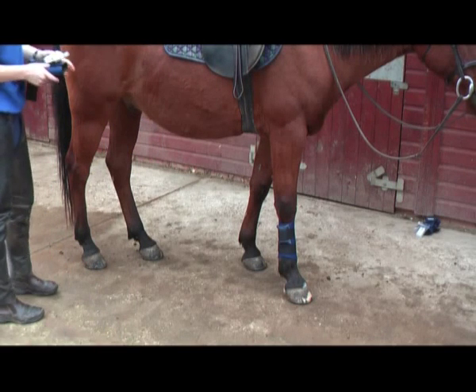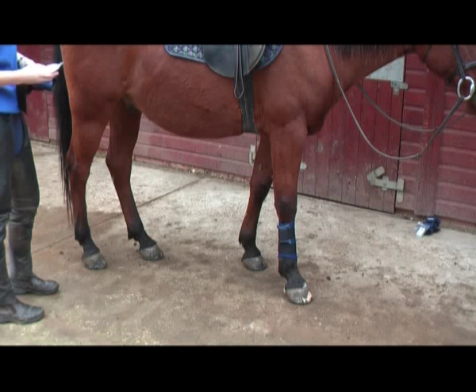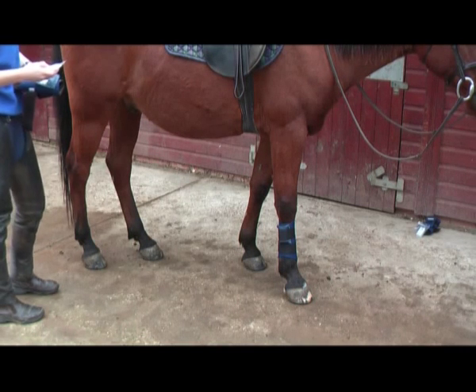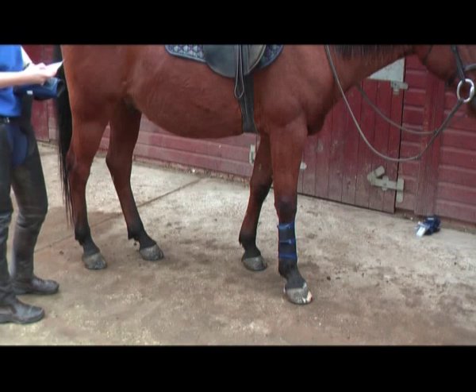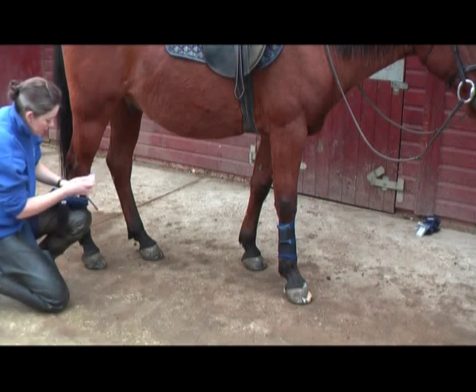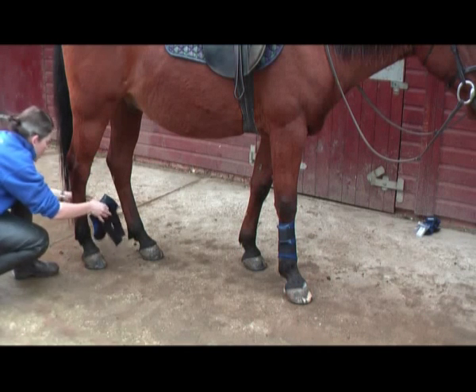I'm checking that my sensor is the correct one for the correct leg — it says right hind, that's correct. I'm checking that there are no lights at the moment on my sensor. There aren't, so I press the little black button. I now see a green flashing light, which means it's collecting data. I pop my sensor into its little pouch and put on my brushing boot.